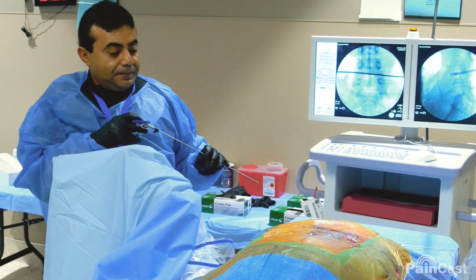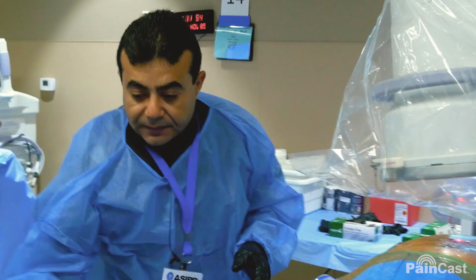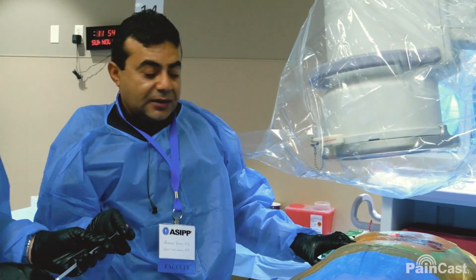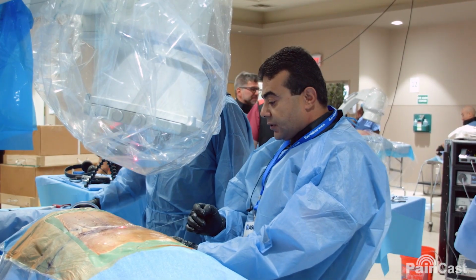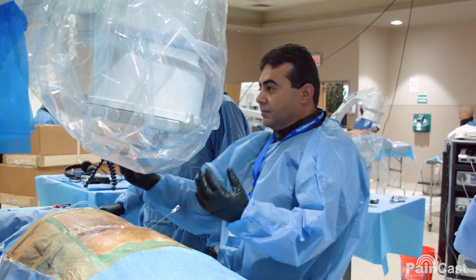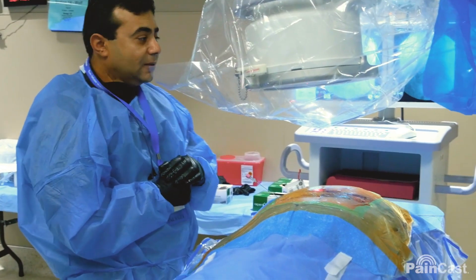Let's go AP. So after marking your spot that you're going to go in, the most important is you never cross the medial pedicular line on an AP and on a lateral view. Okay, you want to come towards me with the whole machine a little bit? Usually go with a 45-degree angle.